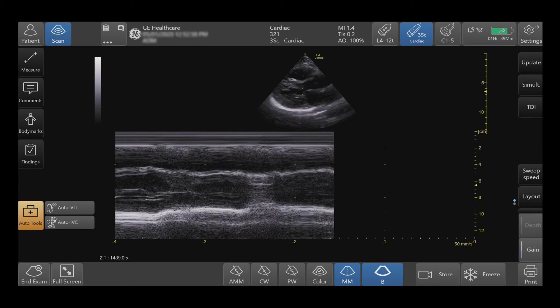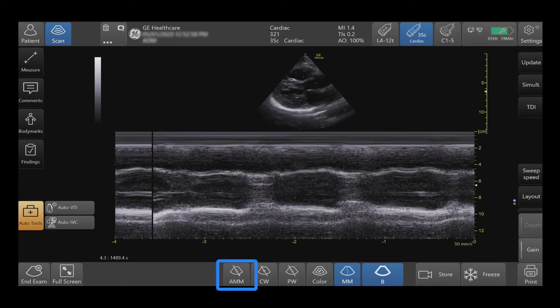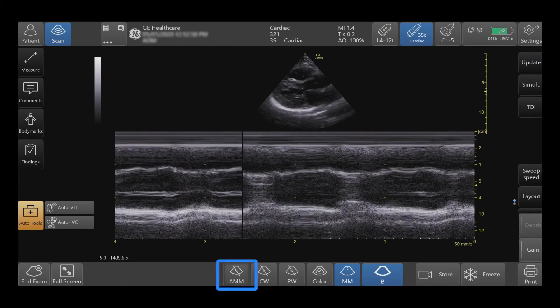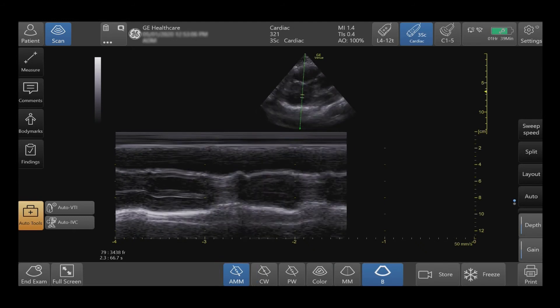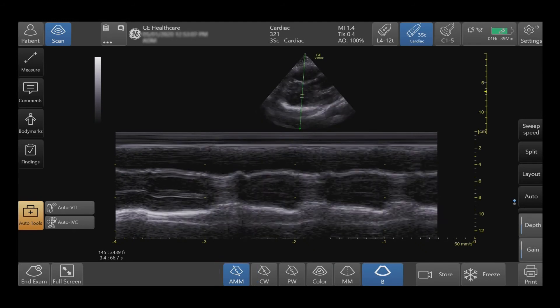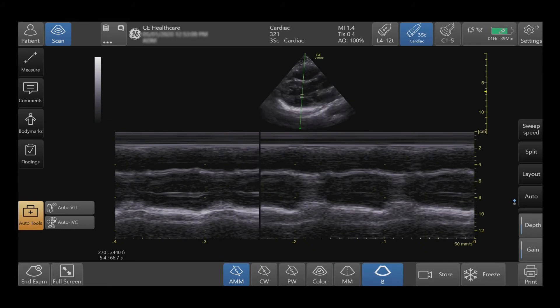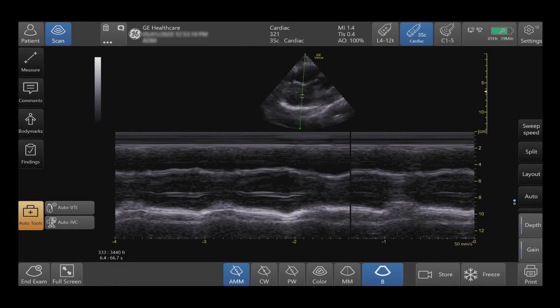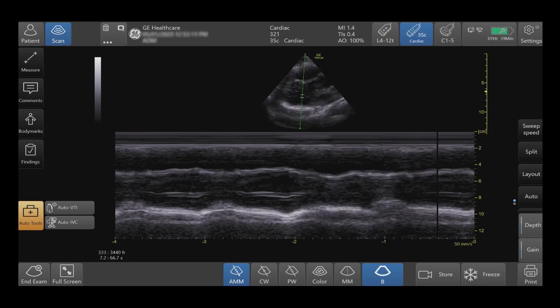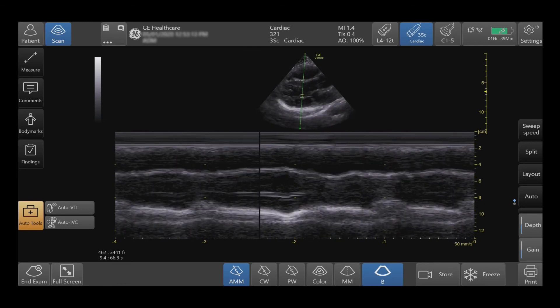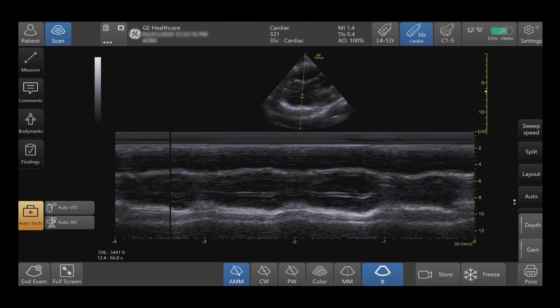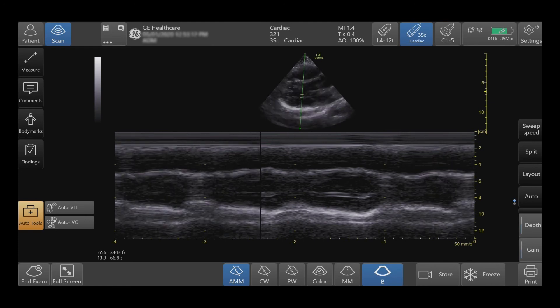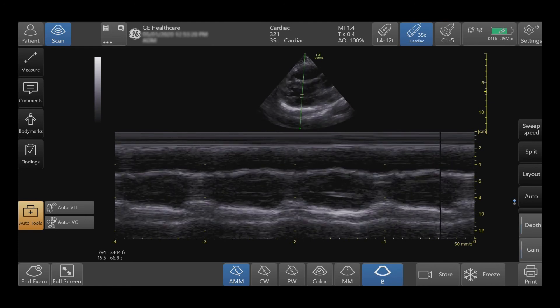To activate Anatomical M Mode, press AMM on the bottom of the screen. AMM is only available on cardiac applications and sector probes. This feature can be used on a live image or a stored video recording. AMM allows the ability to adjust the position and the angle of the M Mode cursor.